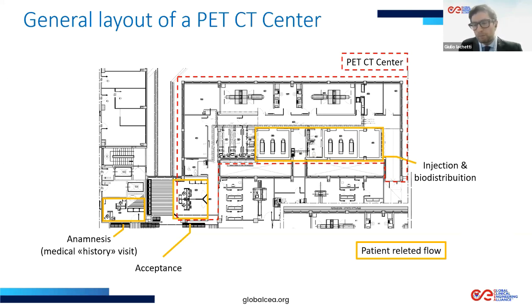It can be, for example, 45 to 60 minutes long. Then the patient goes to the PET-CT scanner and has the diagnostic exam.